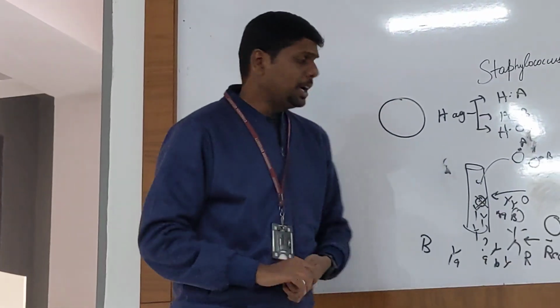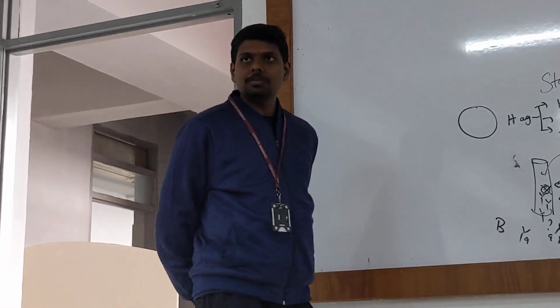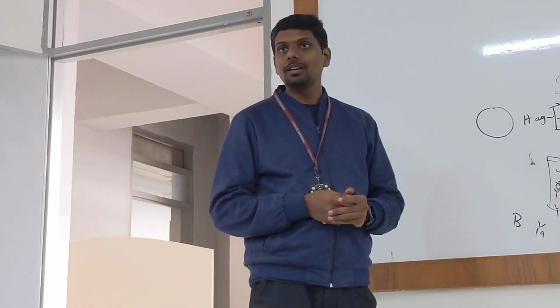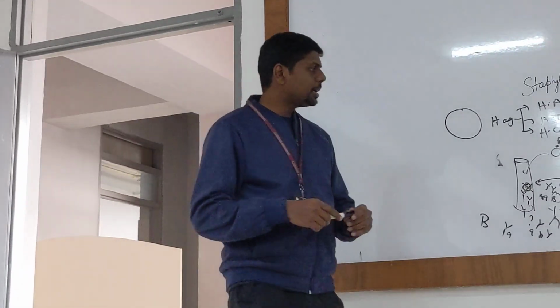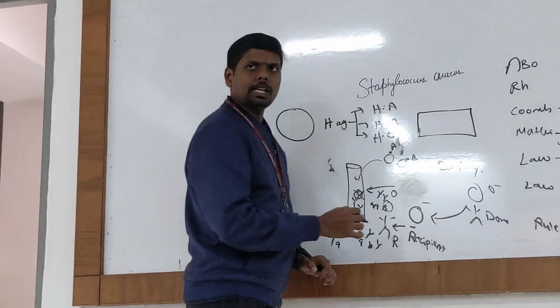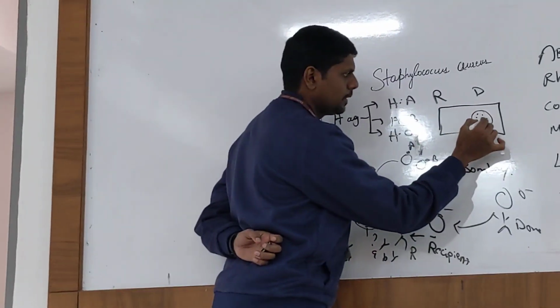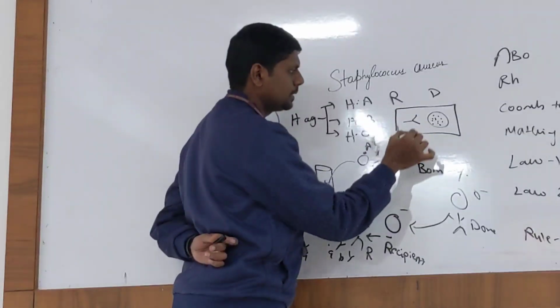Yes, sir. But interestingly, in Bombay, they were surprised. The patient collapsed. The patient died in 3 to 4 hours. His entire blood clotted, and they were shocked. What happened in this? Then what did they do? They took a glass slide. This is the recipient, this is the donor. They took the donor cells and the recipient antibodies.